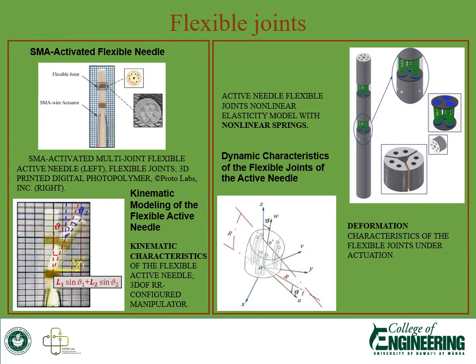One important component of our active needle was the flexible joints, and that's the purpose of this study that I'm presenting here. The flexible joints play an important role in the kinematic model of this needle. As can be seen in this picture, the high deflection of this flexible joint, which is under actuation of shape memory alloys, plays an important role in kinematics. So this paper represents the flexible joint as nonlinear springs.